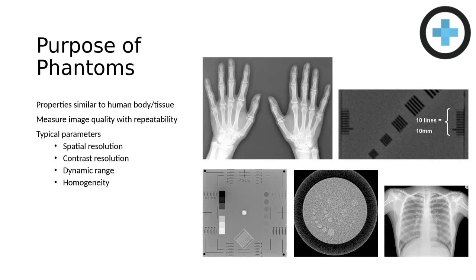Phantoms are also used for assessing and adjusting the performance of imaging devices, such as their resolution and contrast capabilities. When changes are made to an imaging system or when comparing multiple systems, phantoms help verify that the quality of the images remains high and consistent, which is essential for accurate diagnosis and ultimately patient care.